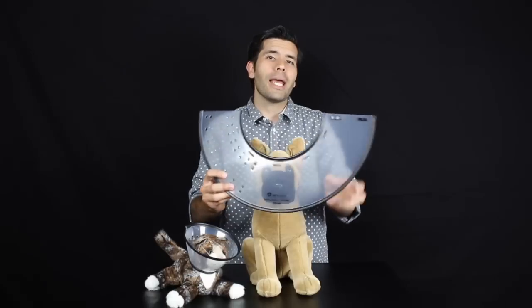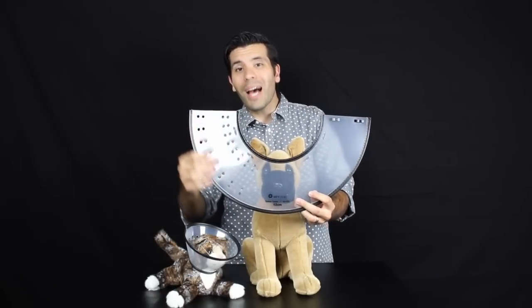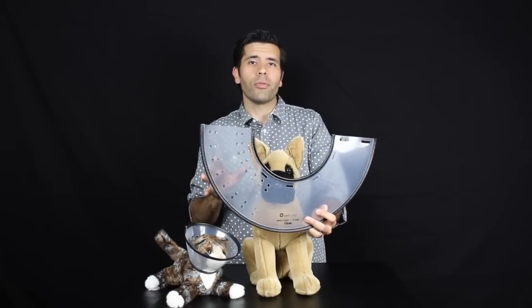This little guy comes in eight sizes, and depending on which size you're going with, you have anywhere from five to nine different attachment points. That means really versatile — it can cover a number of different procedures and a number of different critters, all the way from this little guy and smaller to big giant mastiffs.